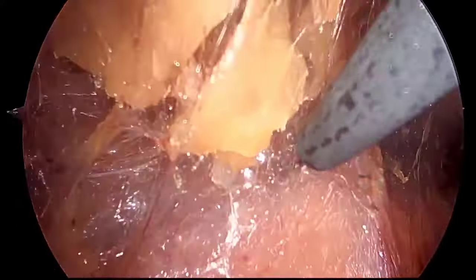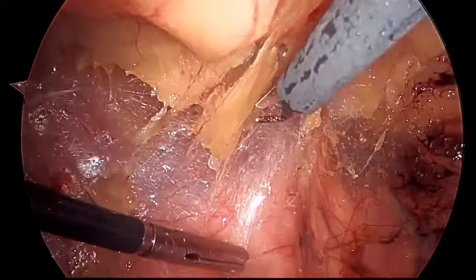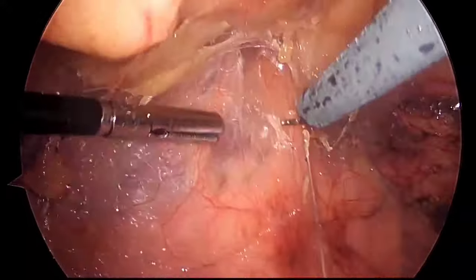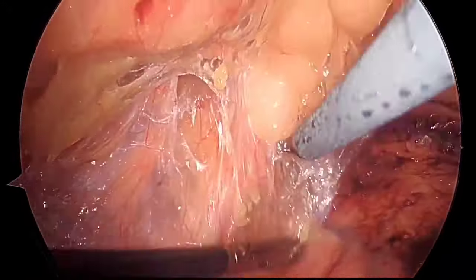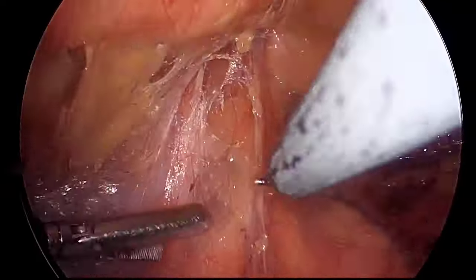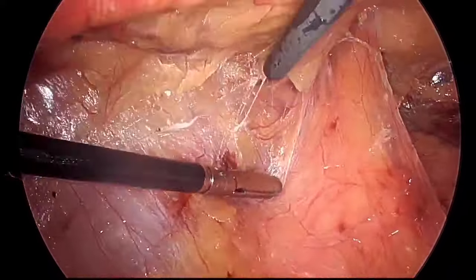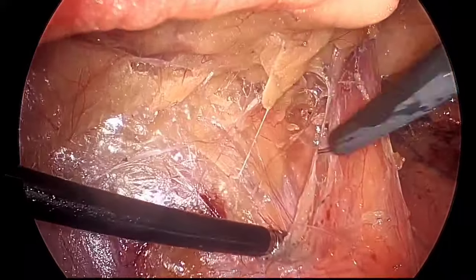Once it is done, for the left inguinal hernia I have also kept one port, the fourth port, on the right side. Now I've changed my camera to the umbilical port, and using the right and left hand ports I'll be doing the left groin dissection.